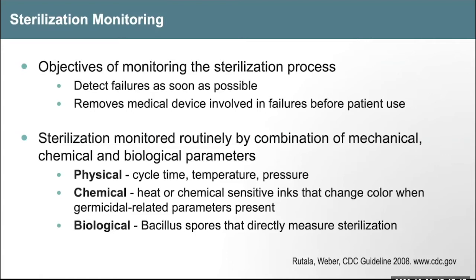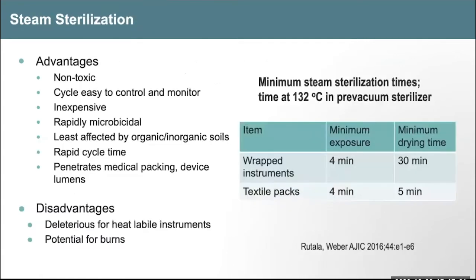And again, they're bacillus spores, but the specific spore used is dependent on the specific sterilization method. Steam sterilization, again, is non-toxic, the cycle is easy to control and monitor, inexpensive, rapidly microbiocidal, least affected by organic and inorganic soils, and penetrates medical packaging, although your packaging needs to be designed for that, and device lumens. The major problem is that it is deleterious for heat labile instruments, and there is some potential for burns.